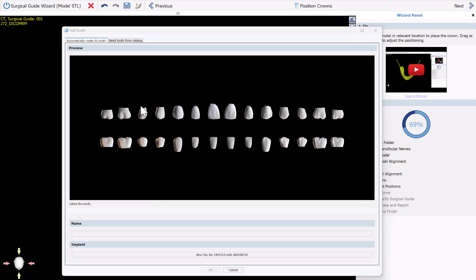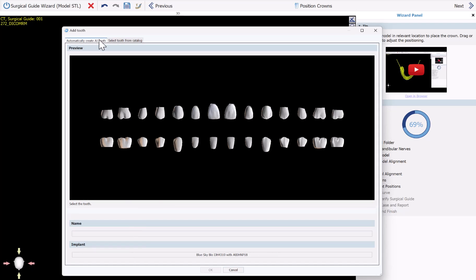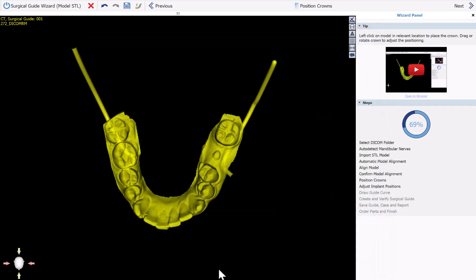Now this is the key step where we're placing the automatic tooth. You can see we now have two options: either create an AI tooth or select a tooth from the catalog. I'm going to make sure I'm on the automatic Create AI Tooth, click on the relevant tooth positioning, confirm the placement of the implant and abutment I want to place, and then click OK and left-click once at the desired location. Now the software is running the automatic tooth generation.